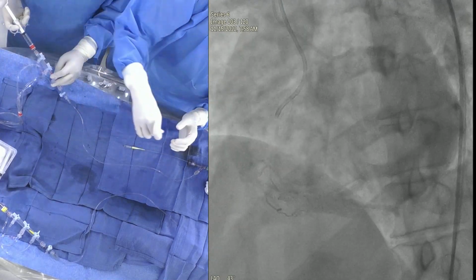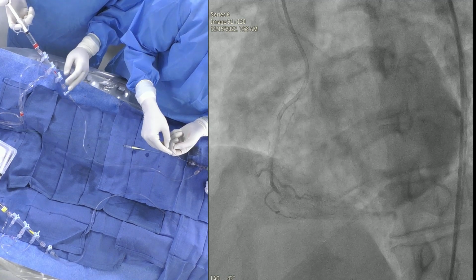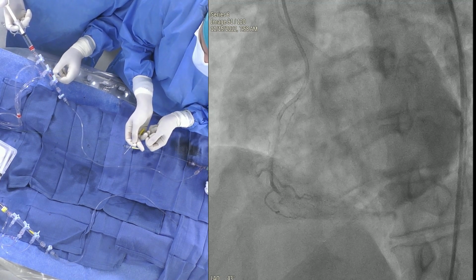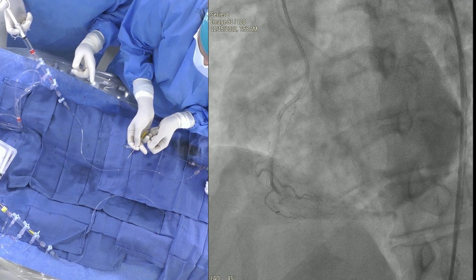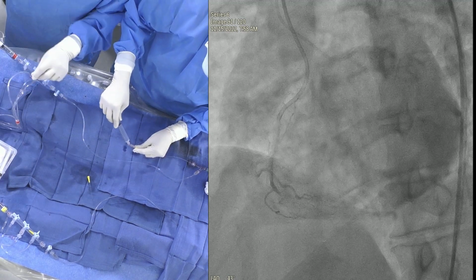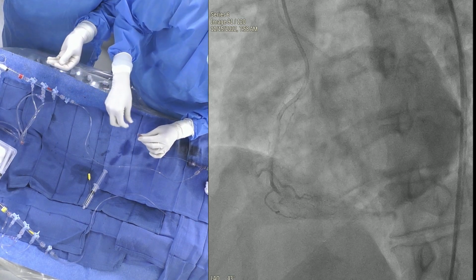Now you want to go to Pilot versus Fielder XT-A or Miracle, it's up to you. These are the various choices, and any of these wires can be done. There's a small curve, if you can see here from the ceiling camera. What wire are we using this time? Miracle 6. Yes, Miracle 6 is the second wire escalation. Good. Now, if they want Gaia, probably the other question is a soft-tip wire, and the Fielder family would probably be the next bet. Pilot versus Fielder XT-A.